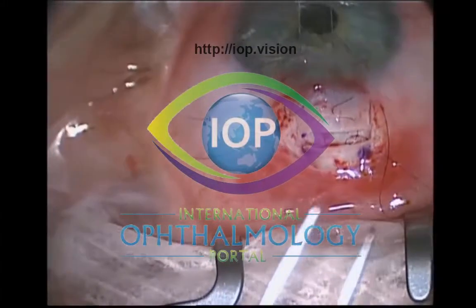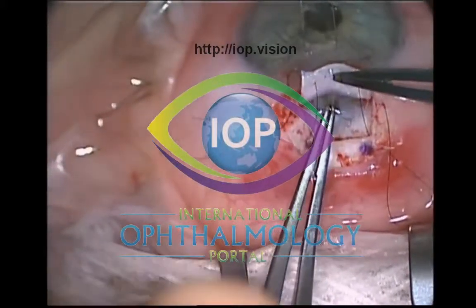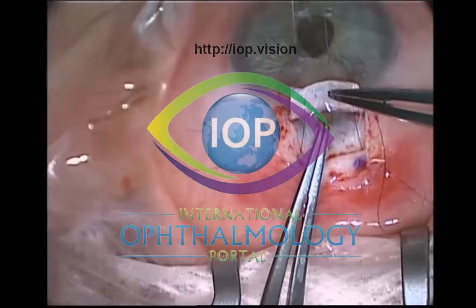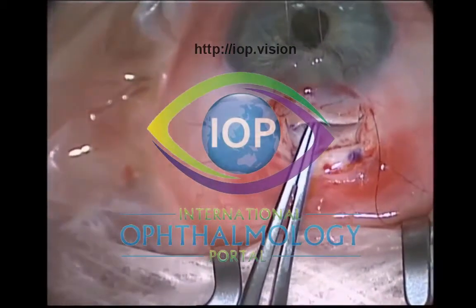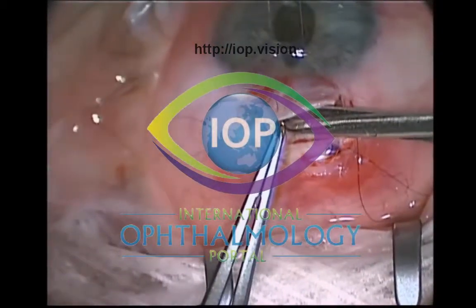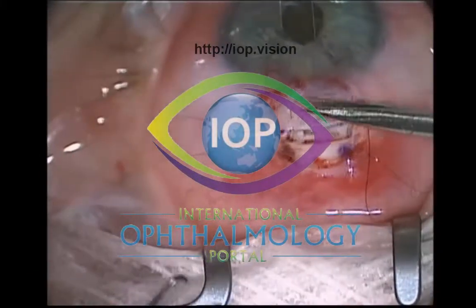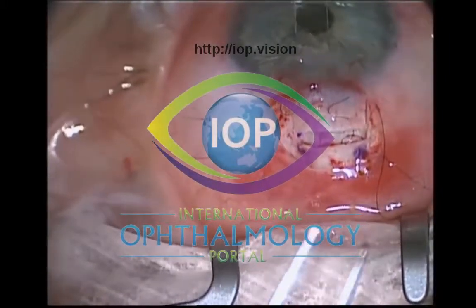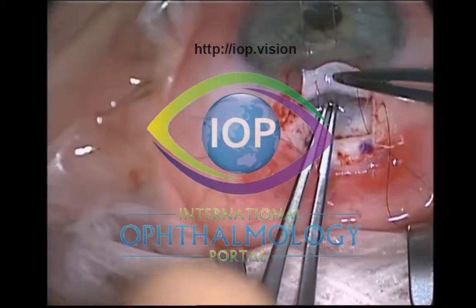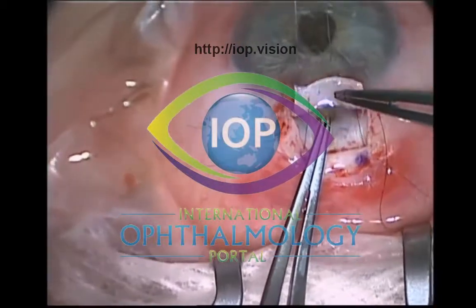If the patient is pseudophakic, the iris actually stays back, and that's when I make the decision whether to do an iridectomy or not. I prefer not to do an iridectomy if I can help it, because there are potential problems: it can bleed if you hit a vessel, you can get vitreous prolapse through the iridectomy into your sclerostomy and potentially block your sclerostomy.